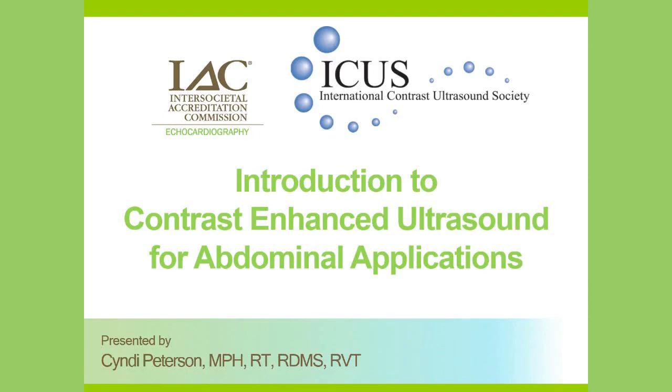My name is Cyndi Peterson, and I have been working with ultrasound contrast agents in radiology settings since 1997. We initially started using contrast agents in clinical trials and then continued to use them outside of trials. And so what you'll be seeing is based on the experience that I have gained during that time.